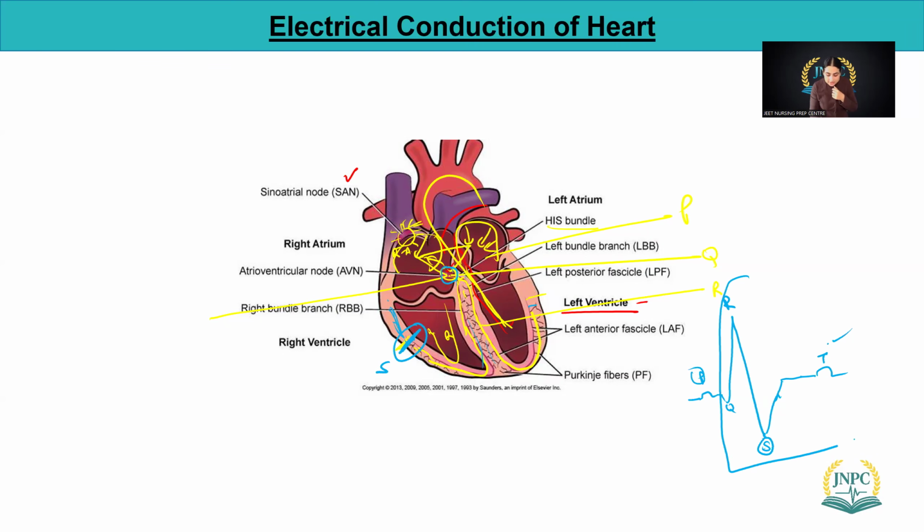Our ventricles are super, super important. That's why we have Q, R, S, and then the T wave. But at the back side, when ventricles are actually contracting, at that point of time, maybe our atriums are relaxing, but we cannot denote those things all together on an ECG paper. Makes sense, right? So we are more worried about how our ventricles are working. If there is any dysrhythmia, specifically in ventricles, that is chaos. That is something very life-threatening. Any question?